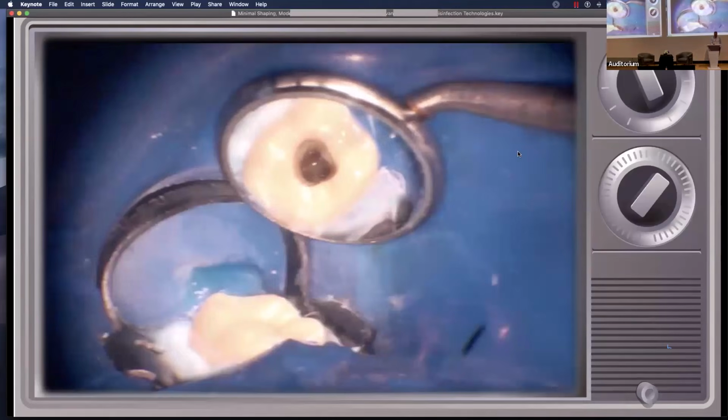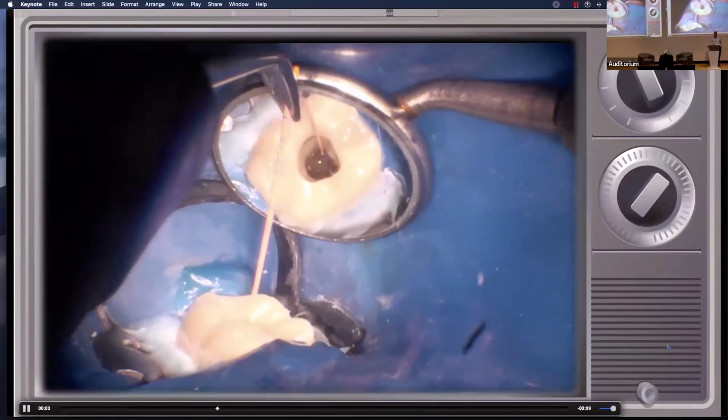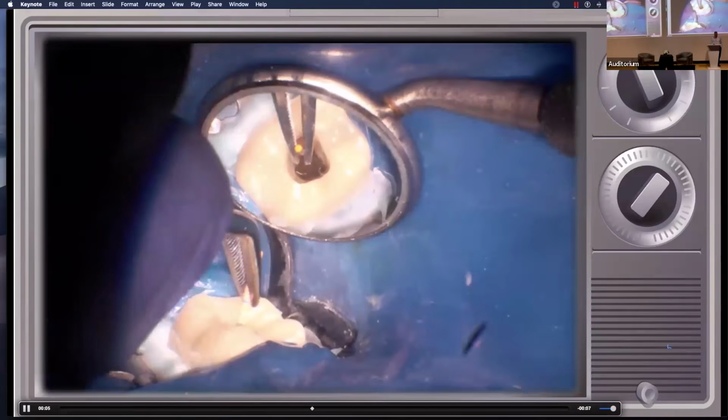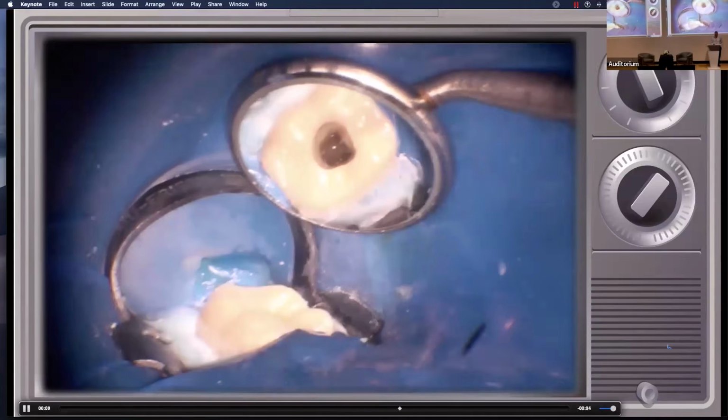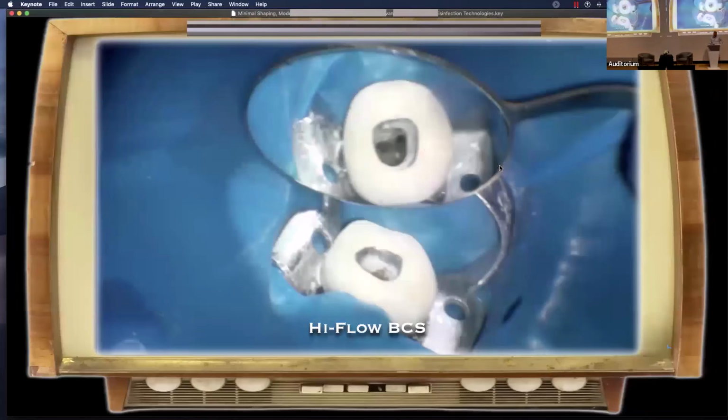Make sense? Okay, I've got a 17 cone. MB is 23 millimeters. And that goes easily to 23. Done. All right, so we wanted to do obturation, and I didn't get obturation on this case. So I pulled in a case from a different patient that shows how we're obturating these smaller shapes and sizes now. So this is a switch of a case here.